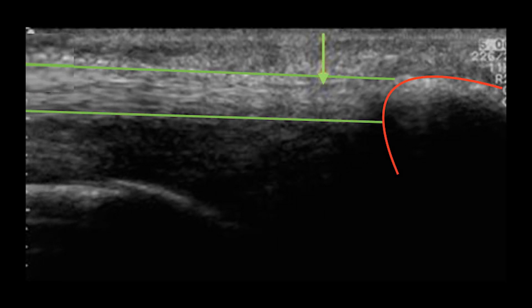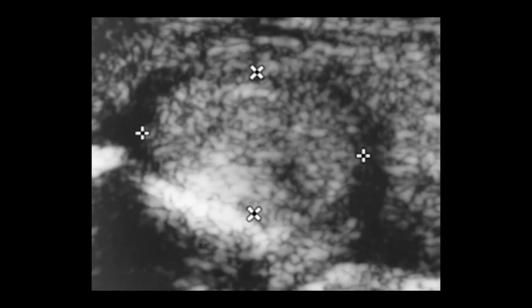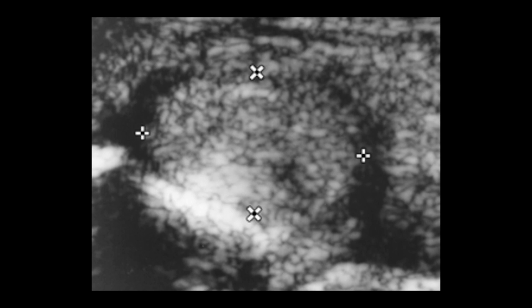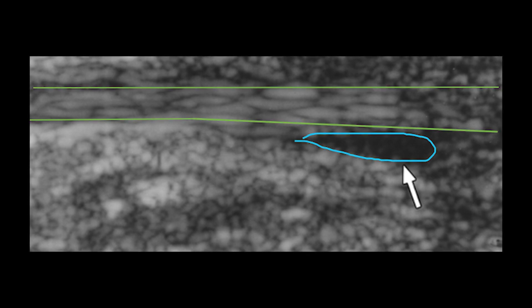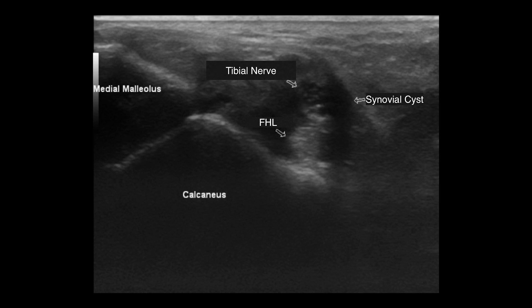If you trace the posterior tibial tendon distally along its course you can see a normal posterior tibial tendon inserting into the navicular. If you evaluate the posterior tibial tendon in the axial view it should appear circular; in this particular case you can see an enlarged, inhomogeneous tendon with peritendon effusion, which is consistent with posterior tibial tendinosis. If this tendon is traced along its course in the longitudinal axis, it maintains normal fibrillar architecture; however, you can see a circular hypoechoic space representing minimal fluid adjacent to the tendon, which is consistent with posterior tibial tendonitis.